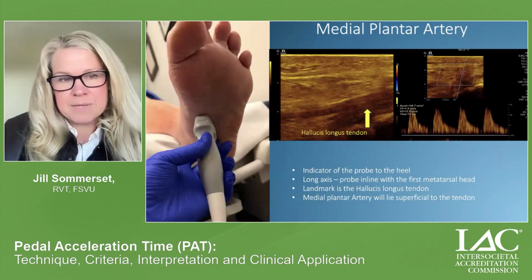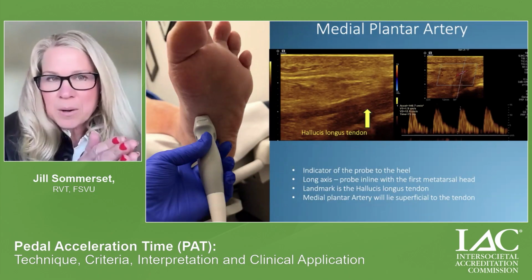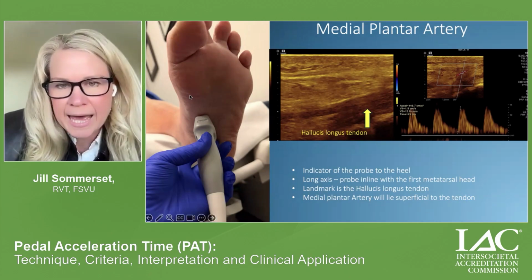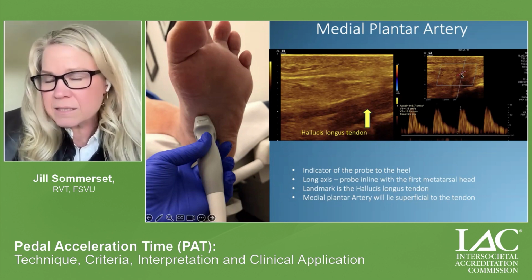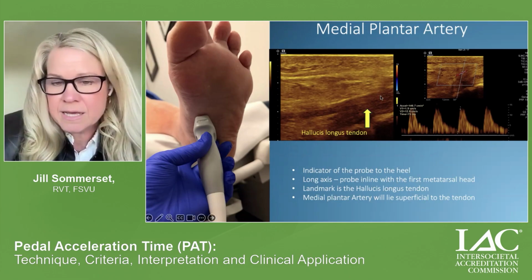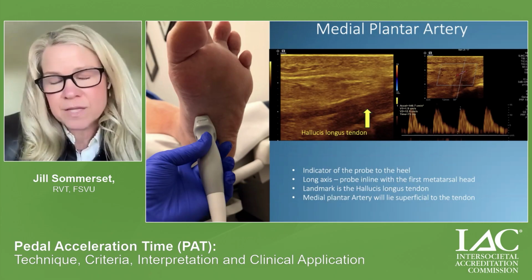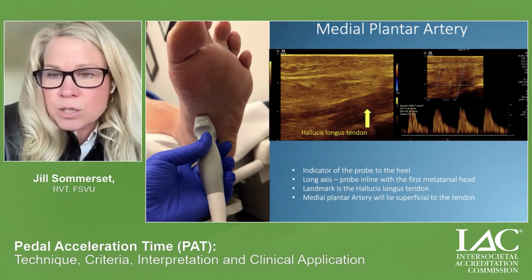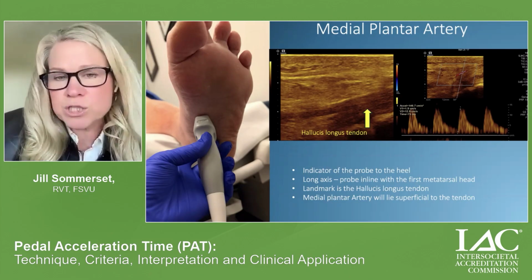And the next step is we're going to slide back to the lateral plantar artery landmark and just slide your probe medially. So your probe is in line with the first metatarsal head. And the major landmark here is the hallucis longus tendon. We're going to apply color, and that medial plantar artery lays superficial to that hallucis longus tendon. And generally, the medial plantar artery is smaller in caliber if the lateral plantar artery is patent. If the lateral plantar artery is occluded, the medial plantar artery is generally spared and will be more generous in size.